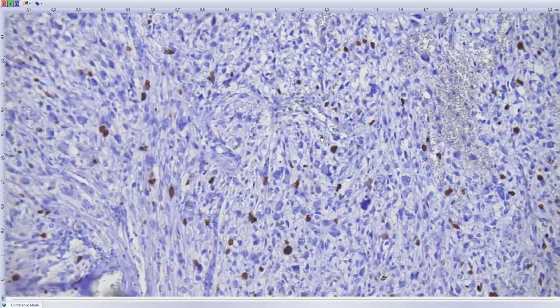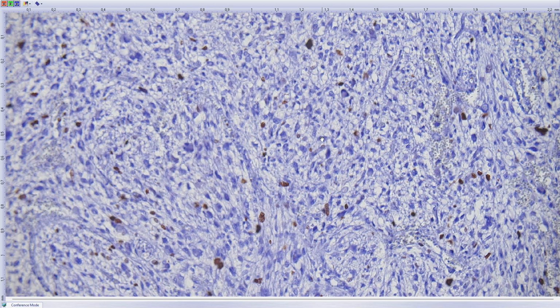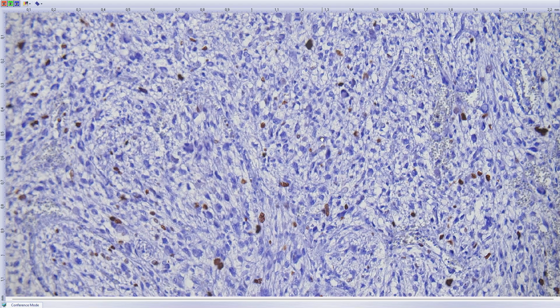So we have performed genetics to rule out other things, and the tumor shows a very typical KIAA1549-BRAF fusion with typical localization. I believe it's pilocytic astrocytoma, but because the proliferation is quite high and shows brisk mitotic activity, it was classified as pilocytic astrocytoma with anaplastic features.